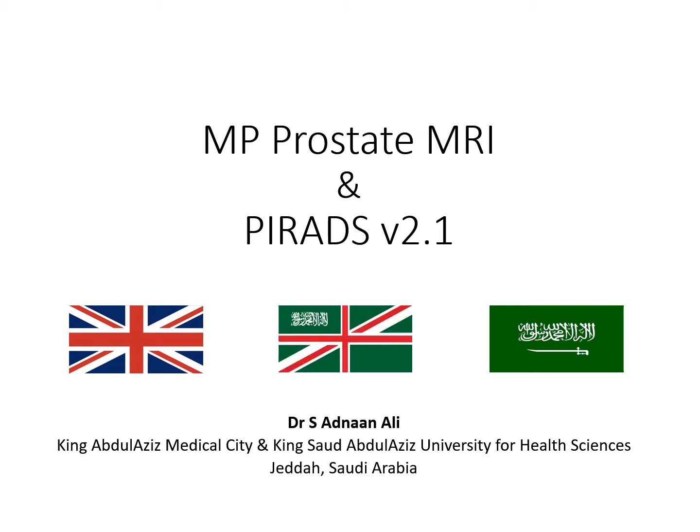So I'm just going to go through some details regarding multi-parametric prostate MRI and the newly revised scoring system, PIRADS version 2.1.